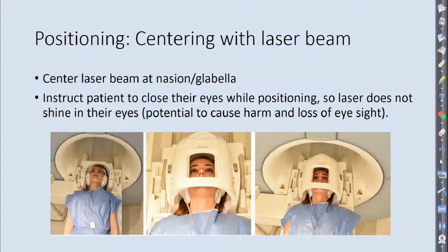Remember to have the patient close their eyes or put their hand over the laser light so you don't harm their retinas. Clip the coil on and plug it in. Sometimes you think it might be plugged into the table. Just make sure it's nice and secure into that coil.